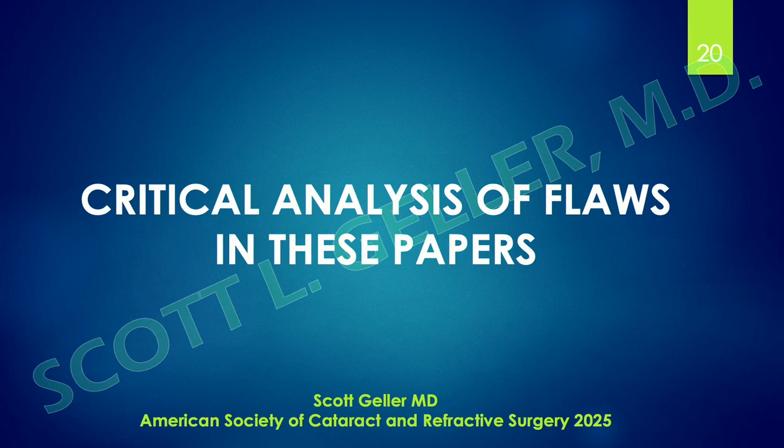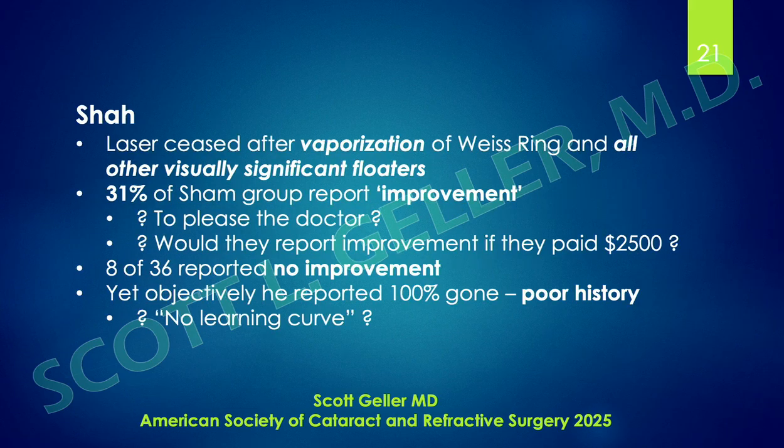Let's go over some of these papers with a critical eye to see what flaws they have in their methodology and their conclusions. Dr. Shah out of Boston, well-known retinal specialist, said in this paper, laser ceased, that is the laser treatment, ceased after vaporization of the Weiss ring and all other visually significant floaters.